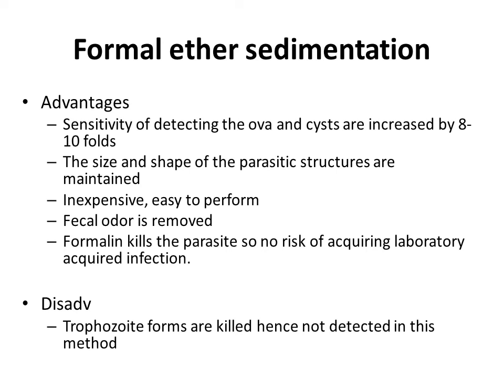Formalin is a fixative or preservative, so it kills the parasite. When it is killed, there is no risk of acquiring laboratory infection. As a laboratory scientist, when we handle living parasitic stages, we may get infected. When we use these techniques, formalin kills the parasite, so there is no risk.